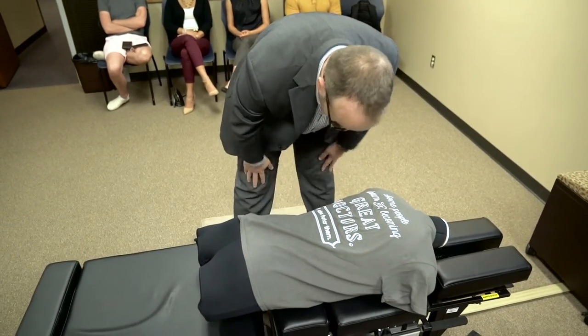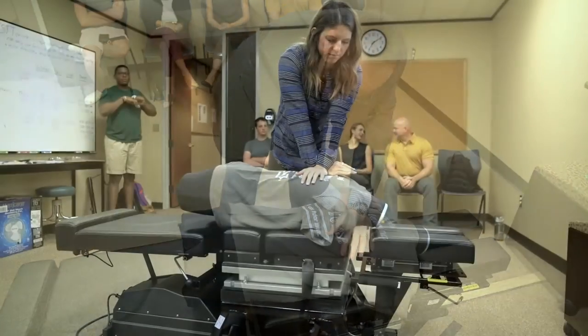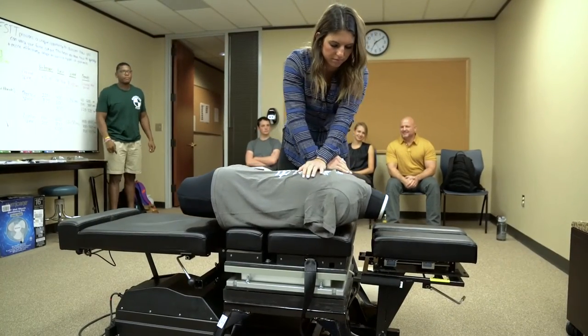Students can come in, give an impulse on this table, and immediately get feedback in ways they've never seen before in the chiropractic profession — this is how much force you put in one direction, this is how much force you put in a different direction, and how fast you're doing it. This gives rich feedback to students to make them the best adjusters they can be.